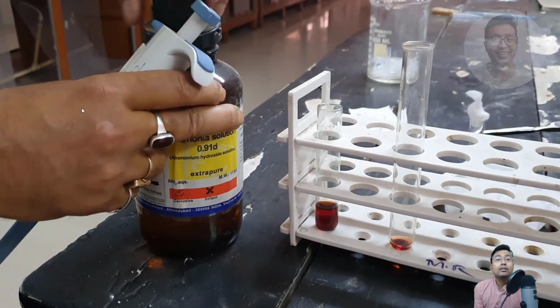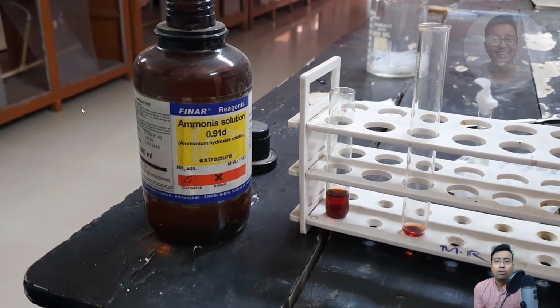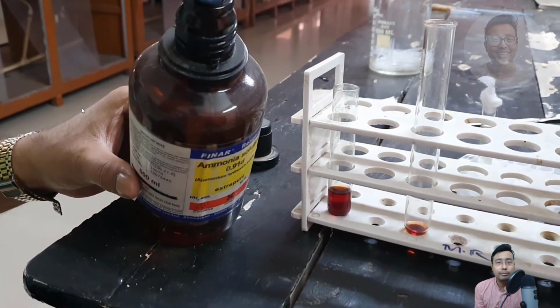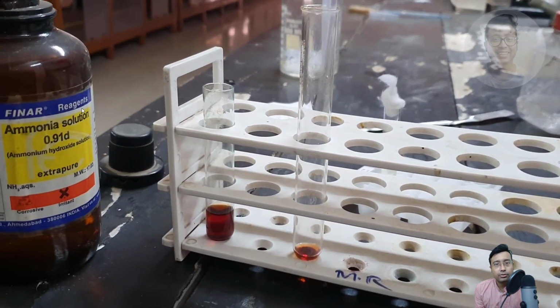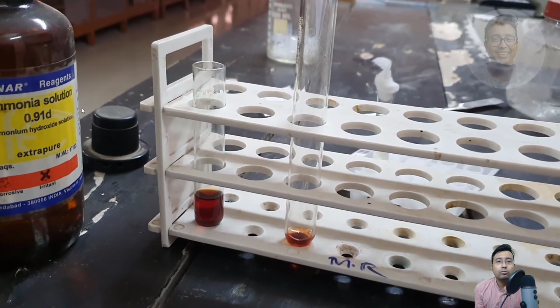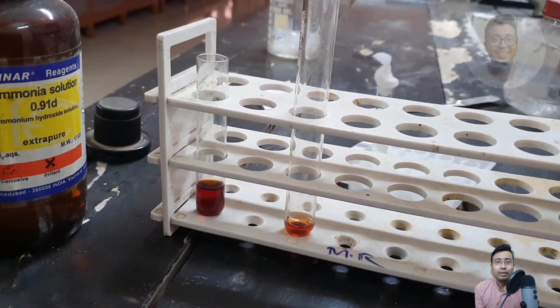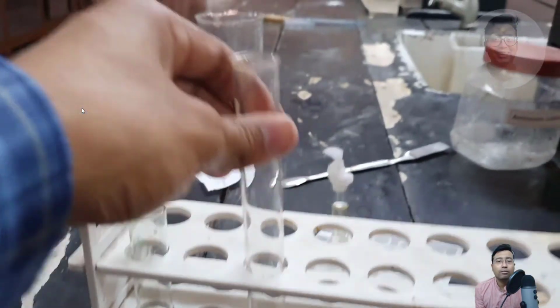You can see this is a solution of ammonia. Roughly equal volume of ammonia you need to add and mix with the freshly prepared sodium nitroprusside solution to make an ammoniacal solution of sodium nitroprusside. So 1:1 you need to mix, and you can keep this solution for a minute, but these two liquids are very highly miscible, so it will dissolve no matter what.